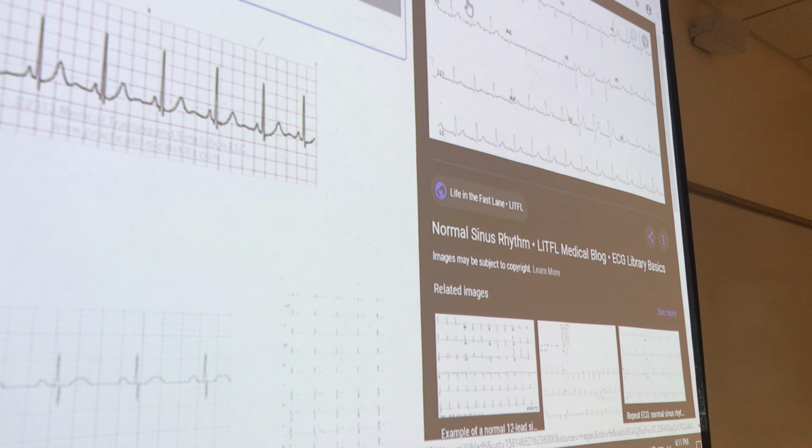If you have an issue in the posterior wall, we can tell. Anterior wall, we can tell. Now, why am I mentioning this? We can have a 12 electrode, or 12 lead, system. And remember, the first 2, usually the waveforms deflect upwards because it goes from here, here, and down. Remember, as we stimulate the SA node and the AV node, that wave of stimulation happens from top right downwards.